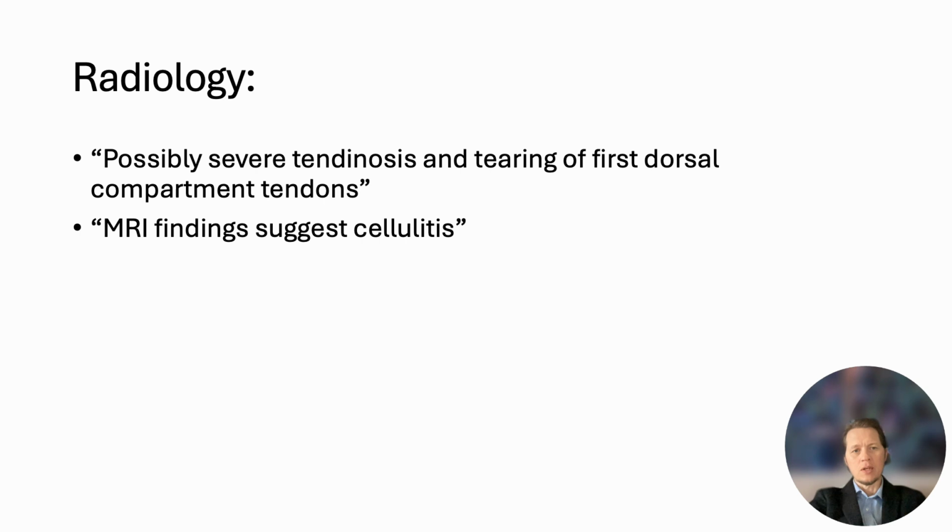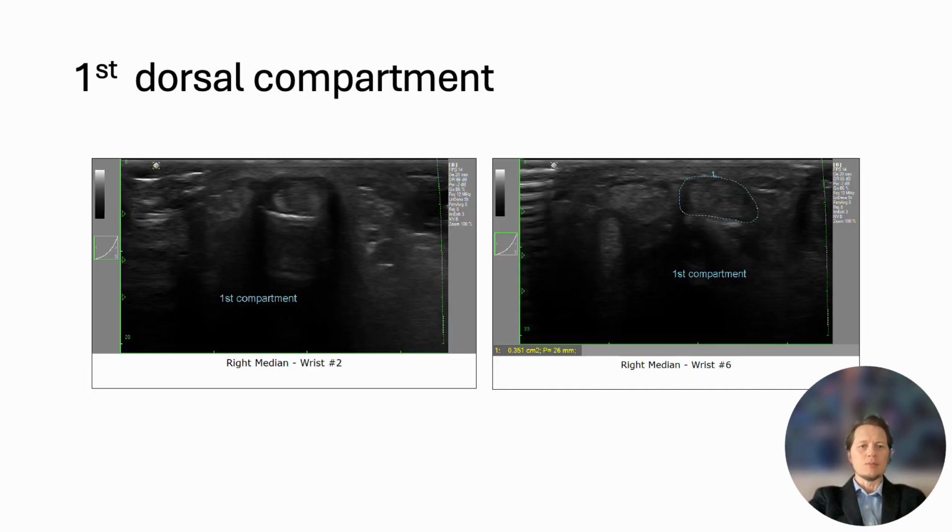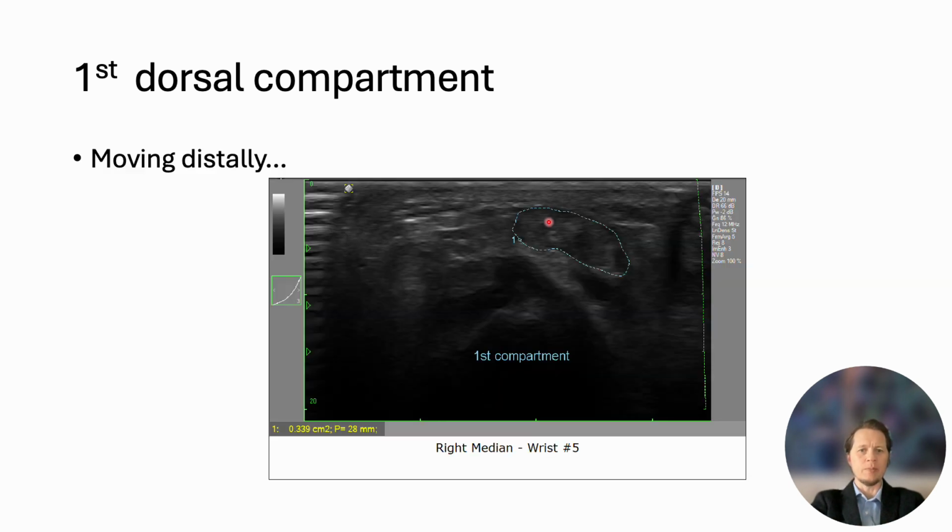So I went a little bit out of order there, showing you some of the initial median nerve findings just to clump that with the carpal tunnel. But now we get to her first dorsal compartment. So this is more proximally, and the compartment tendons are really bunched together. You cannot really see much. Not too much tenosynovitis, maybe a slight black ring around there, but not too bad.